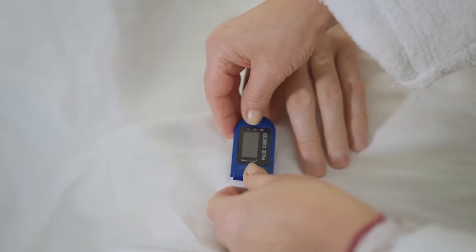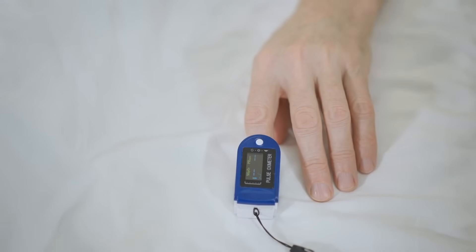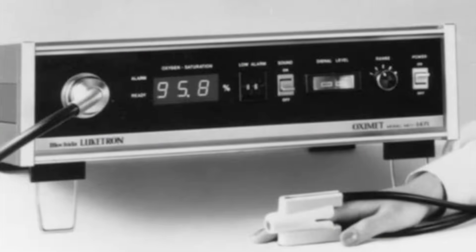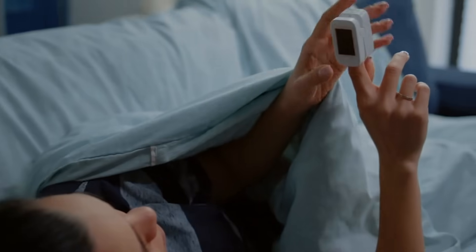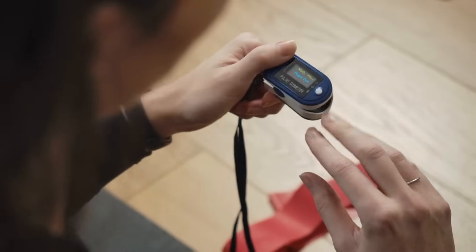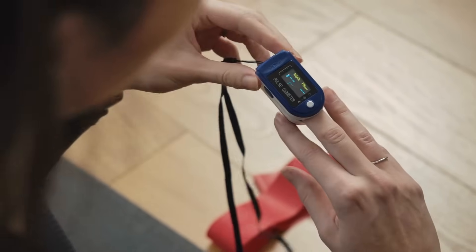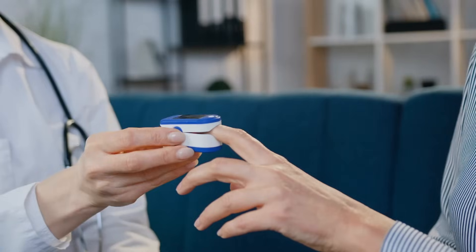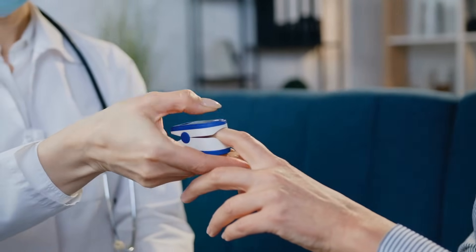As with most technologies, pulse oximeters have come a long way since their inception. Early models were bulky, expensive, and confined to hospitals. Today, they're sleek, portable, and affordable enough for personal use. Some even integrate with smartphones or fitness trackers, offering a wealth of health data at your fingertips. Advances in sensor technology and algorithms continue to make them more accurate and user-friendly.